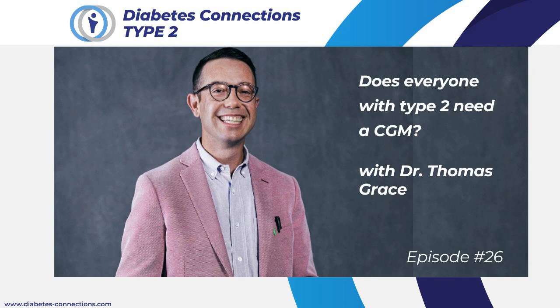Yeah, so Clarity is web-based software for both the end user, people with diabetes that have a continuous glucose monitor, and for clinicians. And for people using the smartphone app on their phone, they can see their glucose readings, but they can also go back in and historically look at data. Dexcom G7 really pushed us forward with that. It's all at the patient's fingertips. So even if a clinician didn't have Clarity in their office, they could walk in and at their fingertips have all of their historic glucose data there. Now, what we find is most clinicians are interested in that, and they're using that in the office to look at historical data and kind of compare it.